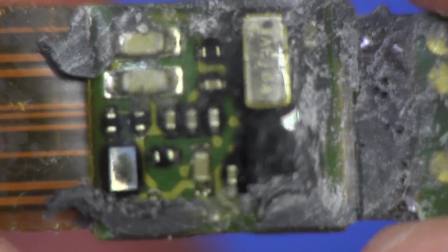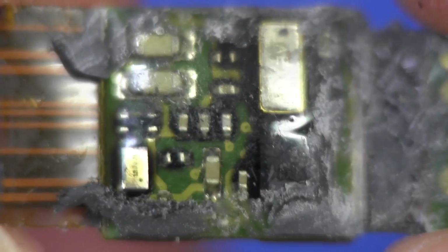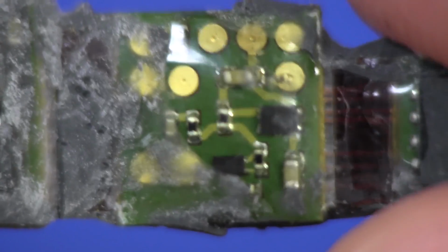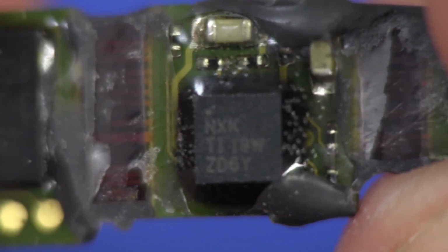And these really would be a pain in the ass to assemble, and you would have to go to a specialist rigid flex assembler who really knows what they're doing and can design all the custom jigs to actually hold all these in place while they're assembled, and really is tricky business, not something you would want to do willy-nilly, that's for sure. You'd want to have a very good reason, like, you know, this particular application here, which goes around a wristband.